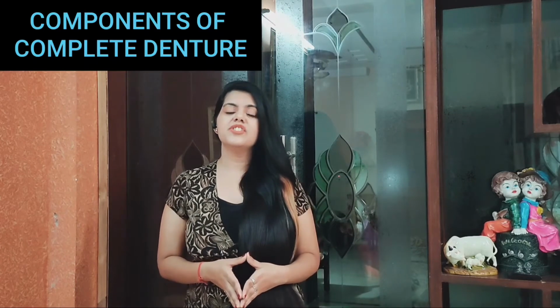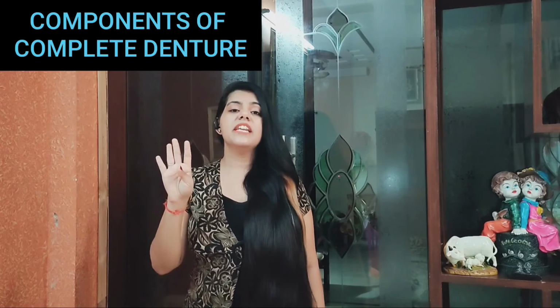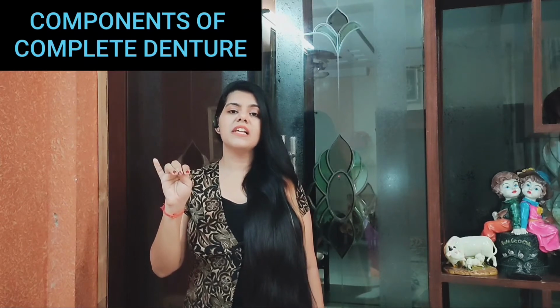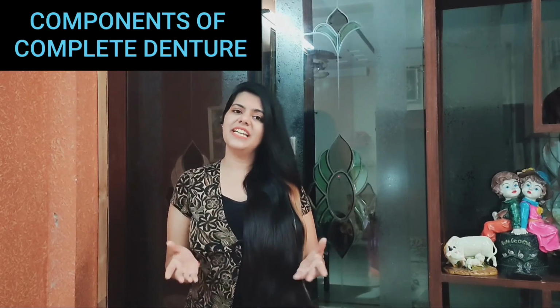Now begin with the components of the complete denture. As we know, there are 4 components of the complete denture. First one is the denture base, second denture border, third denture flange and fourth denture teeth. So we will discuss all the 4 components of complete denture in detail.